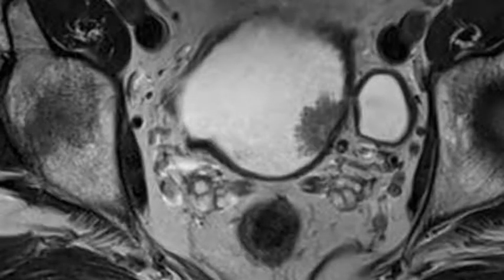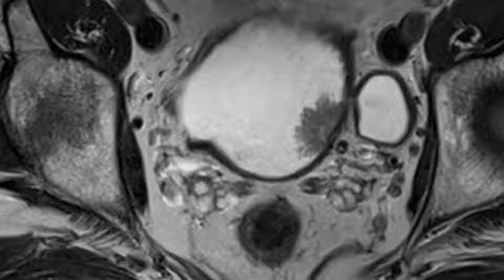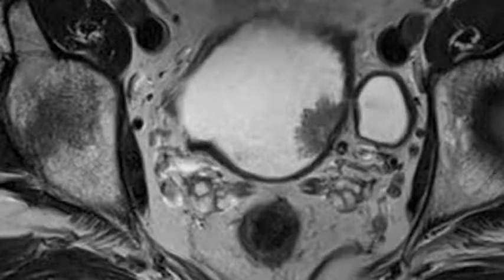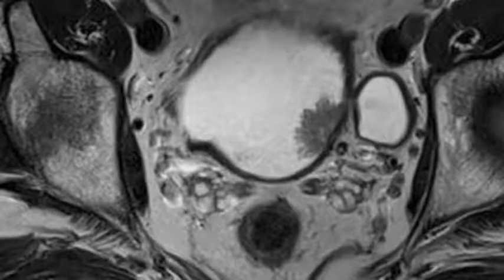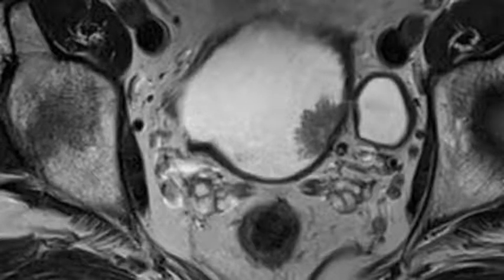Contrast-enhanced MR imaging is only moderately useful in differentiating stage T1 or lower tumors from stage T2 or higher tumors, with an accuracy of 75% to 92%. The overall accuracy of contrast-enhanced MR imaging in determining tumor stage is 52 to 93%. Several recent studies have reported diffusion-weighted imaging to have a high sensitivity and specificity in the staging of bladder cancer.